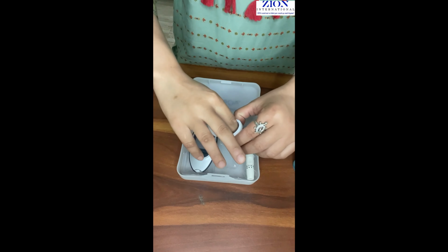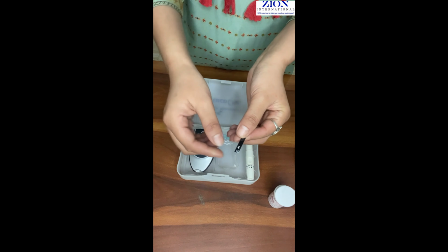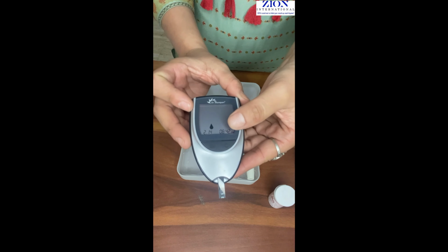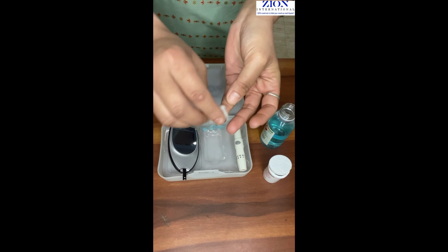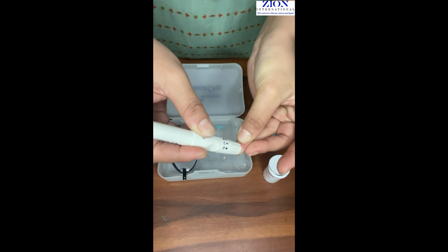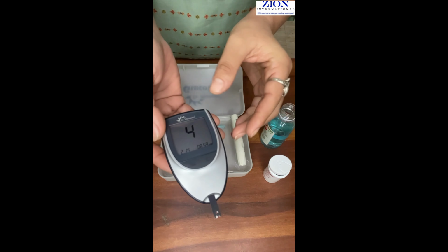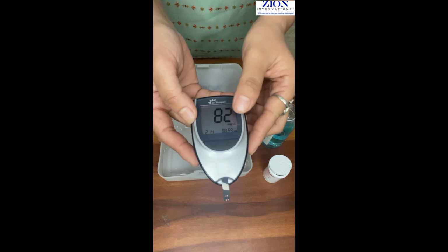Take one strip. You can see the arrow sign indicating. Insert the strip into the glucometer from here. Take the middle finger, clean it with spirit solution and prick, pushing the button of the Lancet pen. Apply a drop of blood on the strip and wait for the results. The meter will display your reading within a few seconds.